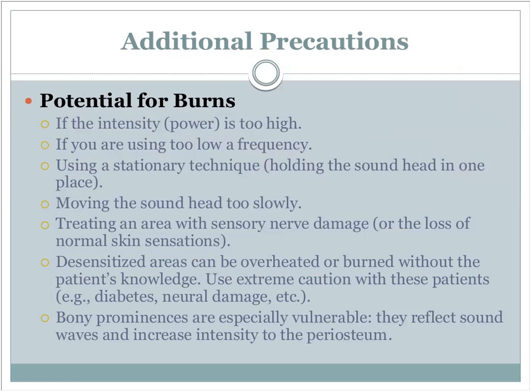Stationary technique, you're not moving the sound head. Moving the sound head too slowly. Obviously, the more that you're pushing into a small area, that vibration creating more and more heat, not giving a chance for that heat to dissipate by moving to another area and coming back to it, you can cause a burn. Lack of sensation for the area, so they can't tell you, hey, that's getting hot. And bony prominences, because there's just not enough tissue in the area to absorb the heat that you're generating.